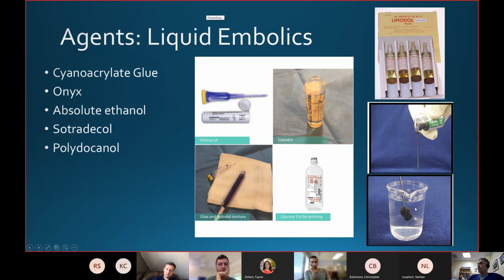It's really used a lot in neurovascular embolization for aneurysms, for example, because it's not going to get your catheter stuck to a vessel in the brain, and it's relatively predictable when you're deploying it. It will not get the catheter stuck to the structure that you're embolizing.